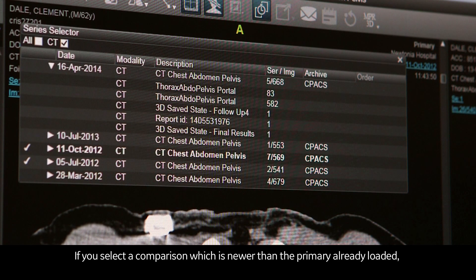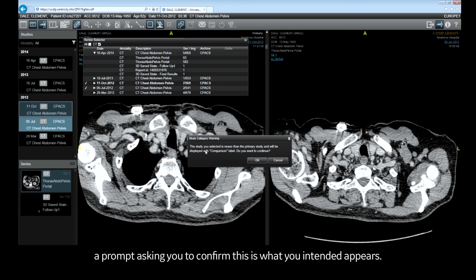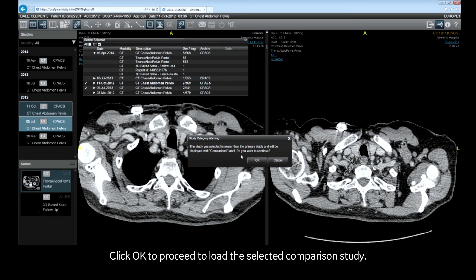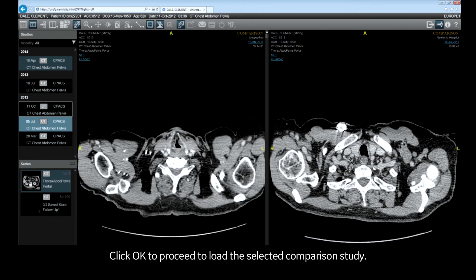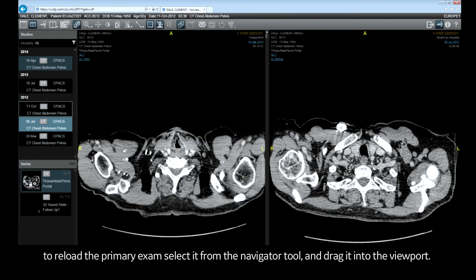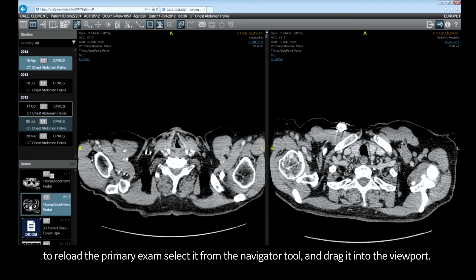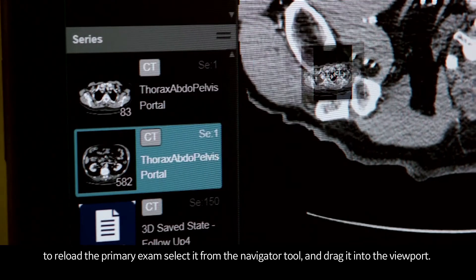If you selected a comparison which is newer than the primary already loaded, a prompt asking you to confirm this is what you intended will appear. Click OK to proceed and load the selected comparison study. To reload the primary exam, select it from the navigator tool and drag it into the viewport.